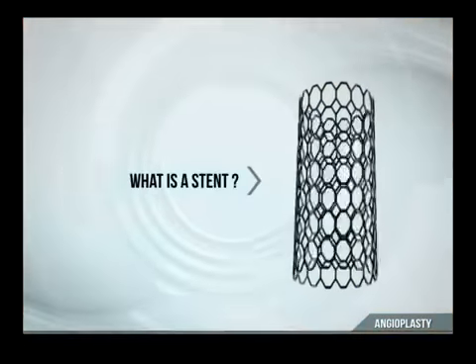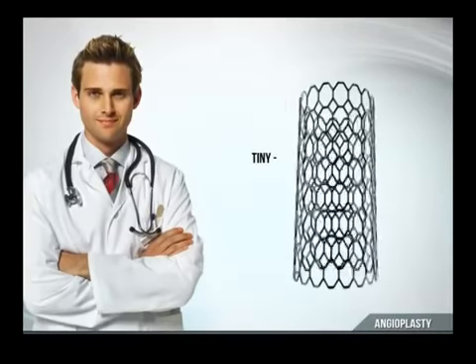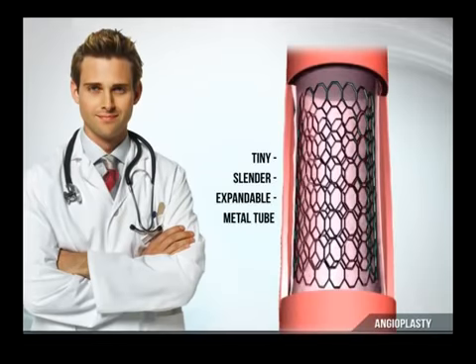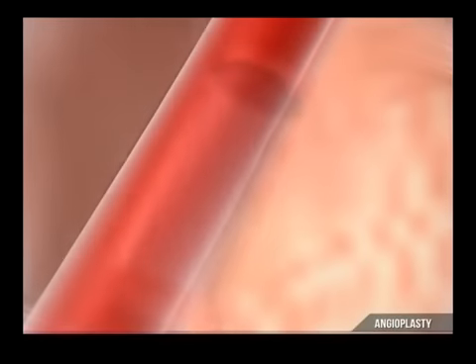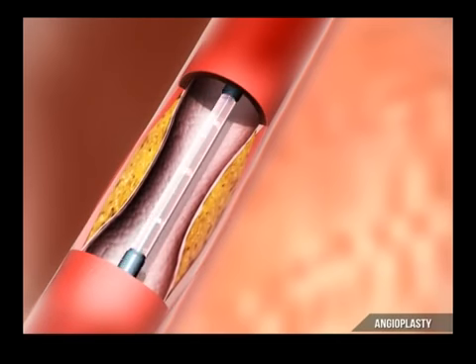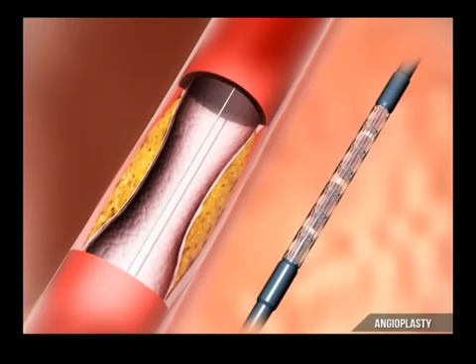What is a stent? A stent is a tiny, slender, expandable metal tube that fits inside a blood vessel once the blood vessel has been widened. To insert a stent, the doctor removes the angioplasty balloon catheter and inserts a new catheter on which a closed stent surrounds a deflated balloon.